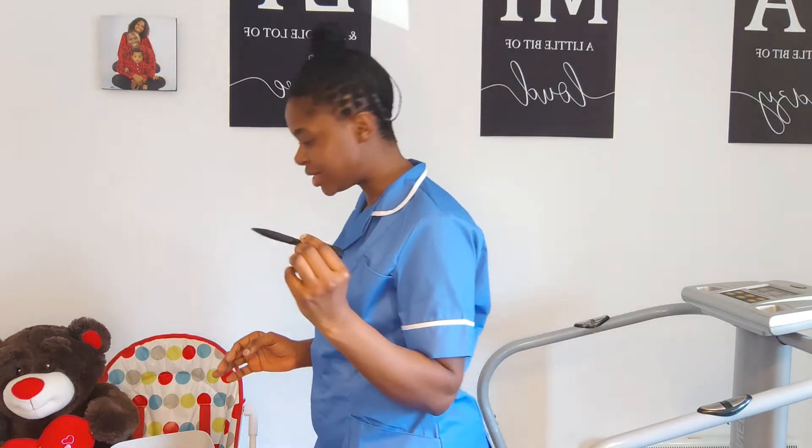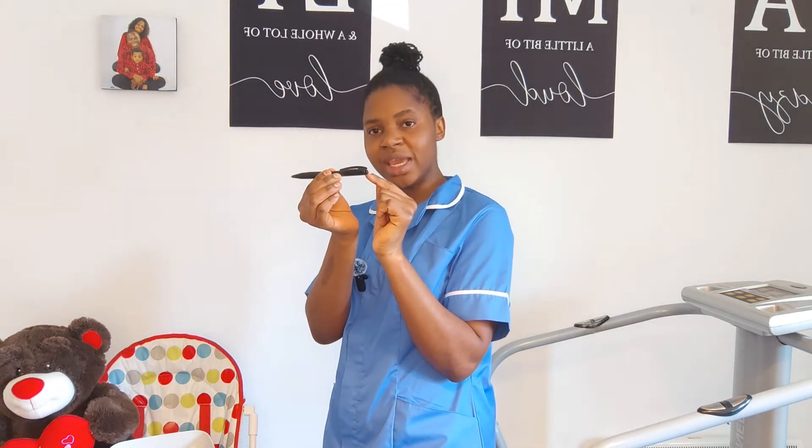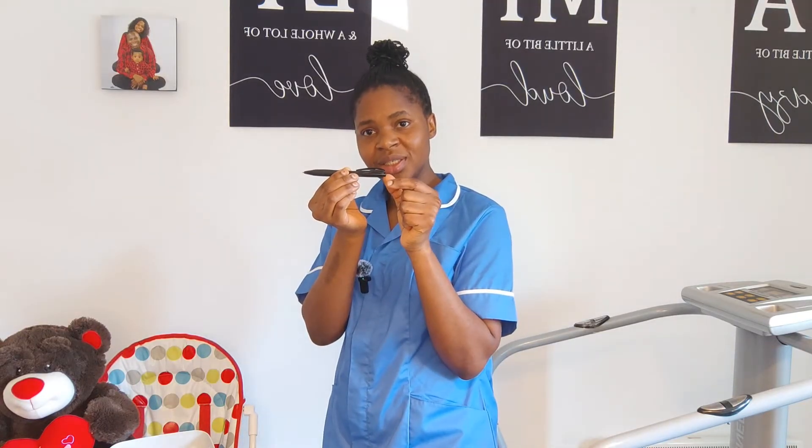I will now prime the needle — this is essential. I set the gauge to 2 and press the button. The medication comes out, meaning the needle is primed. The reason priming is essential is to release any air bubbles. Having done that, I set the gauge again to 14 international units, which is the prescribed dosage for this patient.